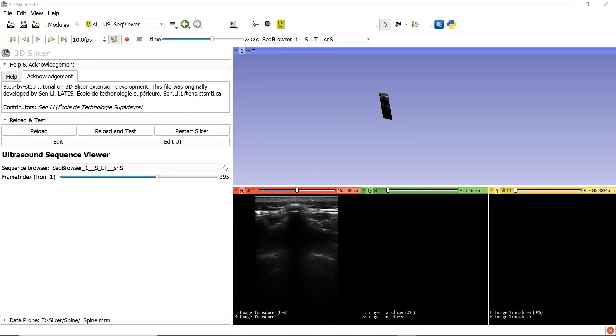We can also see that there can be a difference between the active Sequence Browser, between our custom module and the module given by 3D slicer. We want the two Sequence Viewers to be synchronized because this mismatch can be confusing and not user-friendly. How can we synchronize the two Sequence Viewers and optimize our custom module?